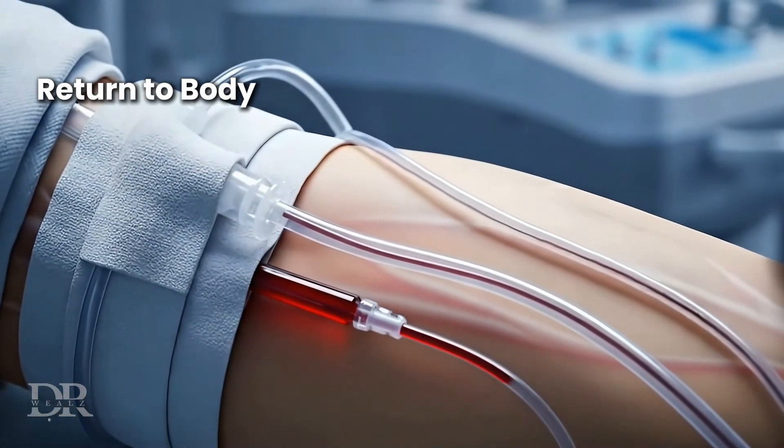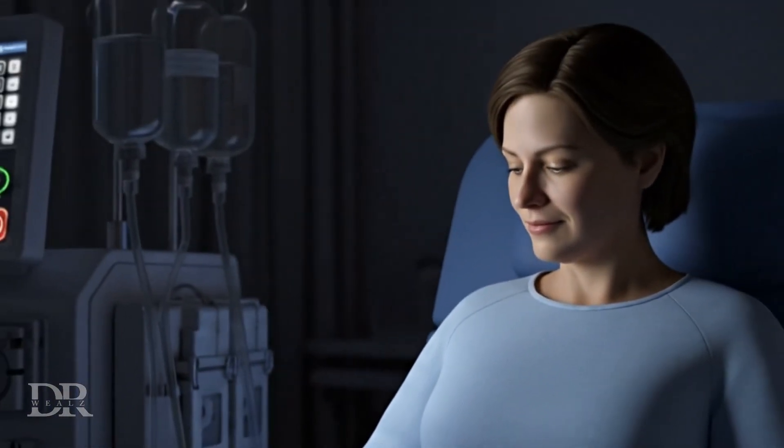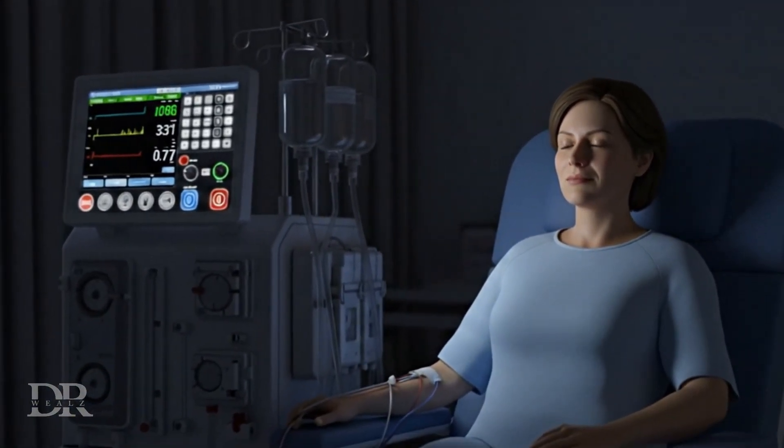The cleaned blood is returned through the second needle. A standard treatment lasts three to five hours, filtering several liters of blood.